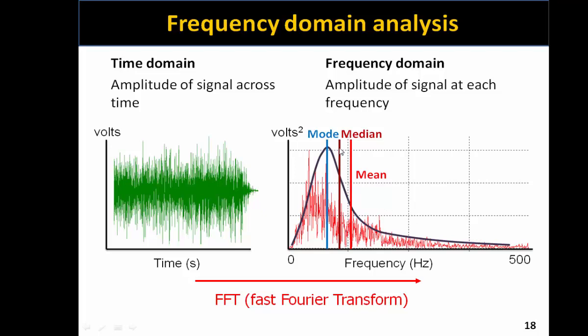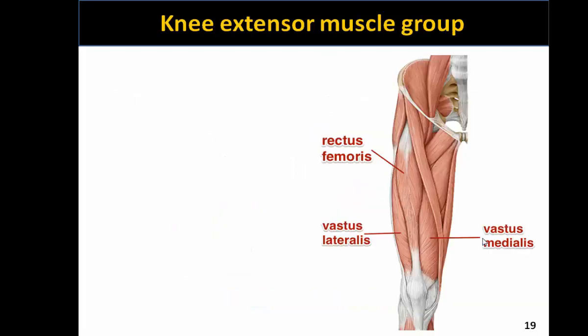The median statistic is insensitive to outliers, which is why the characteristic frequency distribution of an EMG signal is conducive for using the median statistic rather than the mean statistic. And just as a reminder, the positively skewed nature of the frequency profile of a raw signal is inherent to the EMG signal. This is a very consistent pattern that appears in surface EMG signals.